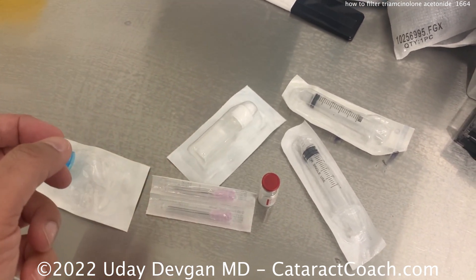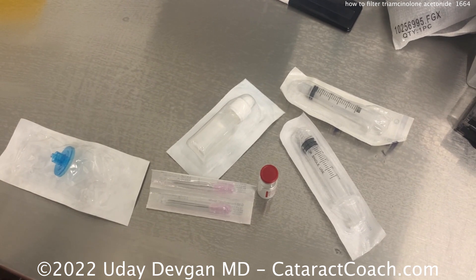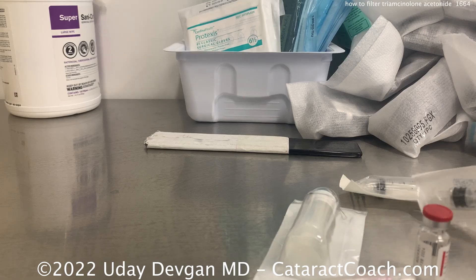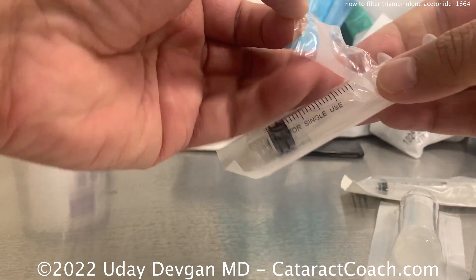I have another video on CataractCoach.com. If you look for Triamcinolone, you'll see how to just resuspend it in the bottle and take out 90% of the preservatives. This is a method to take out all of them.